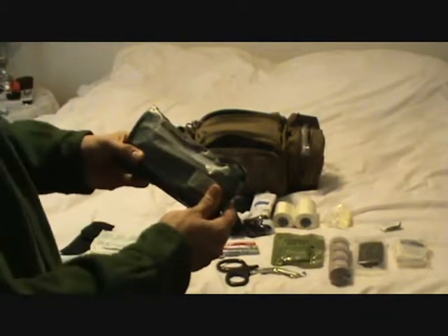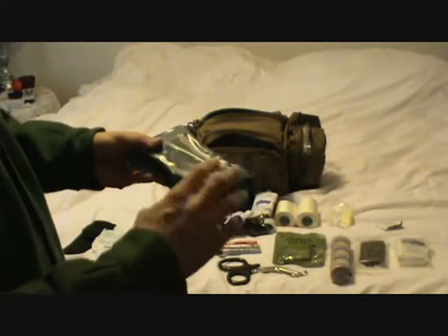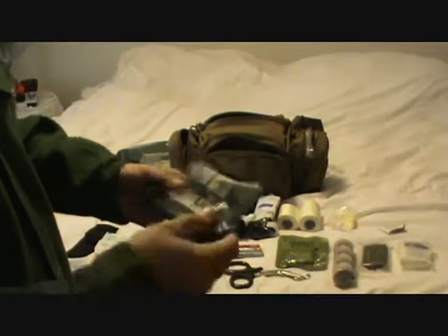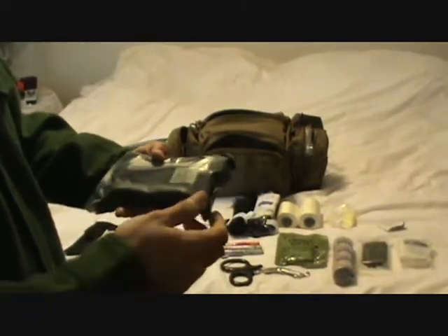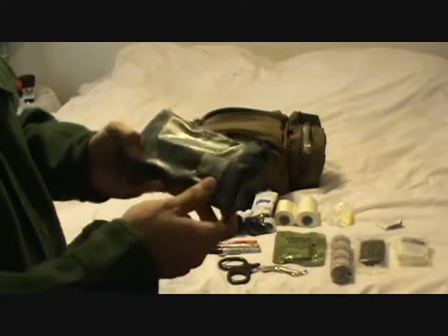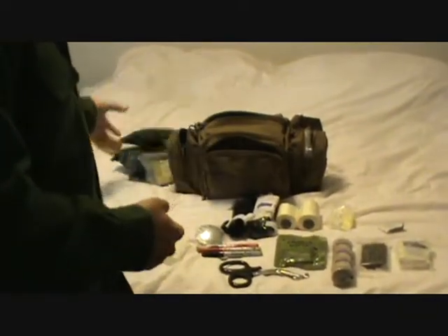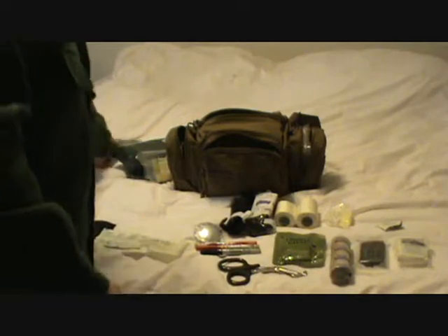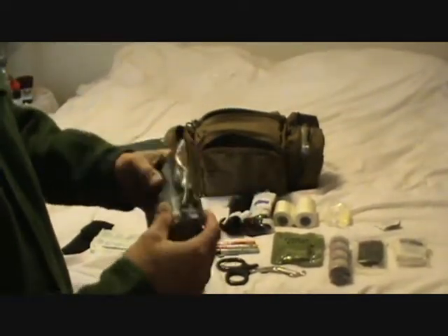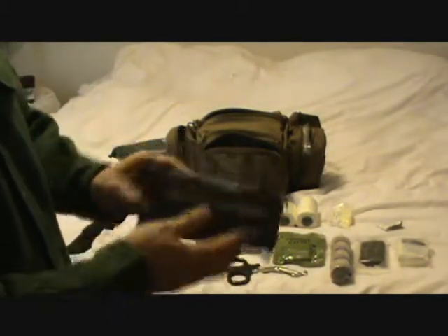Then you have your smaller one. It's about a 6-inch trauma wound dressing is what it's called. You would use this for your arm, and then there's a diagram on the back. You would use this for your arm, your leg, smaller gash, nothing real big. And like I said, they do have expiration dates, and you do want to check and keep your stuff up to date at all times. You never know when you're going to need it, and you don't want it to be bad. I carry, like I said, I think I carry about 5 or 6 of those in my bag. It never hurts to have a couple extra ones of these. Your limbs are the things that are going to carry you out, so make sure you have some of those with you.